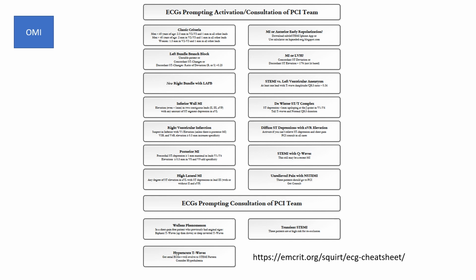It's in a lot of places, and maybe when you're doing studies on it, not all of these signs are 100% sensitive for MI, but neither is STEMI criteria, right? And some of them are better than others. But it also depends on the patient's presentation, right? If you see some of these in isolation, it's not necessarily important.